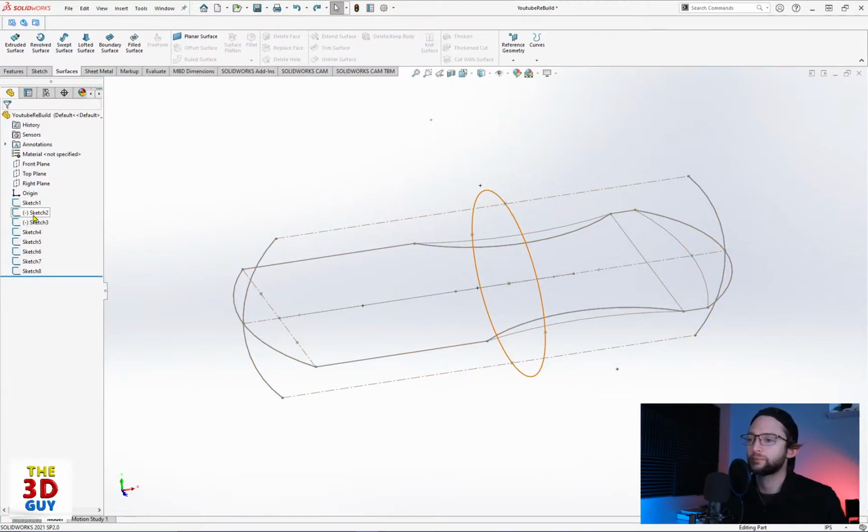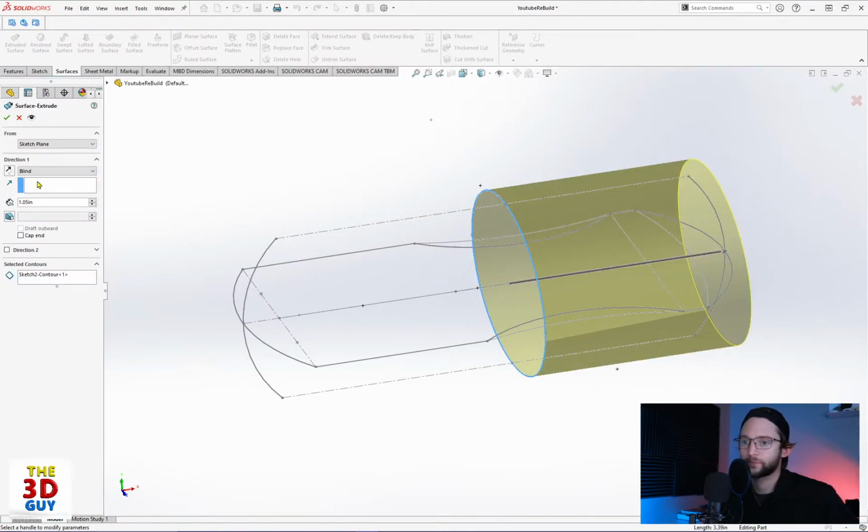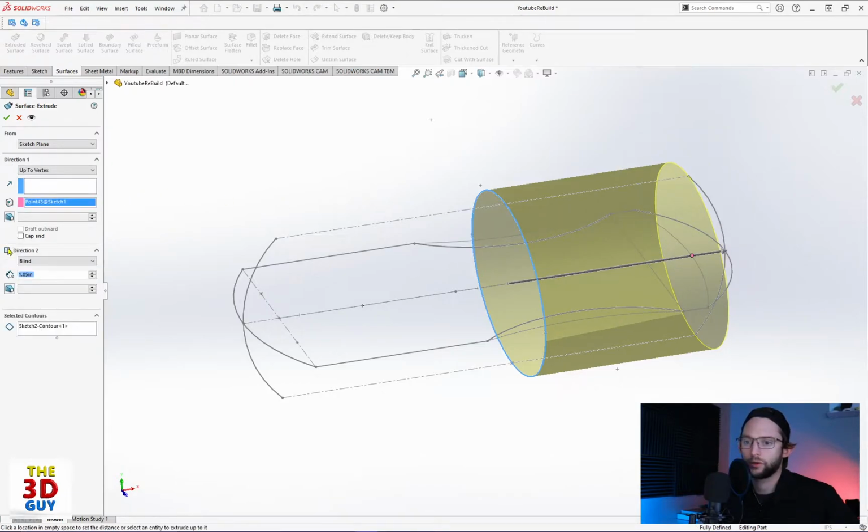So I have the top, side, and front. And then you can see all of these different individual parts that I've also pulled out. All right, so we're going to start off with just an extruding surface. We're going to click on the circle right here. And we're just going to go right to that point.